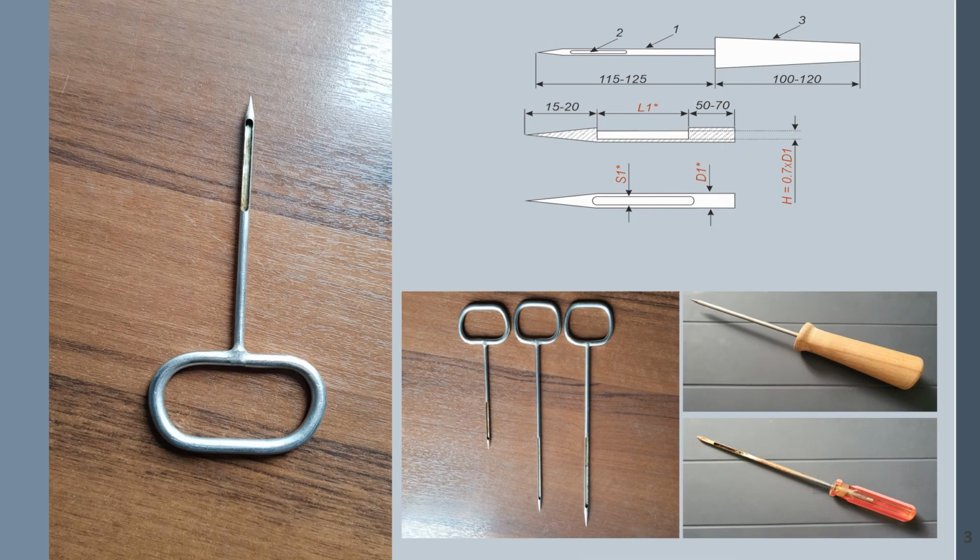To assess the degree of polarization of the oocytes, a biopsy sample with eggs is taken from the gonad with a special probe. Then, after special processing, the eggs are cut open and examined with a magnifying glass or microscopic technique. The probe has a fairly simple device and its drawings are common in many publications. Traditionally it is made of stainless steel.